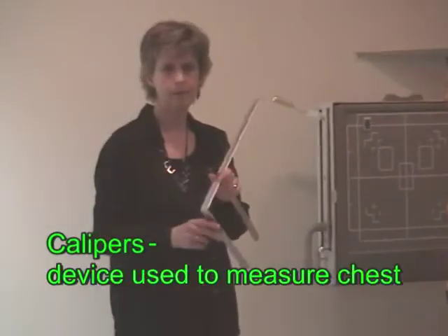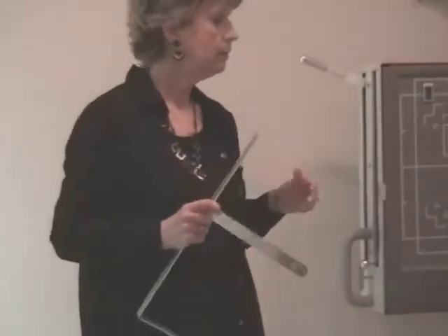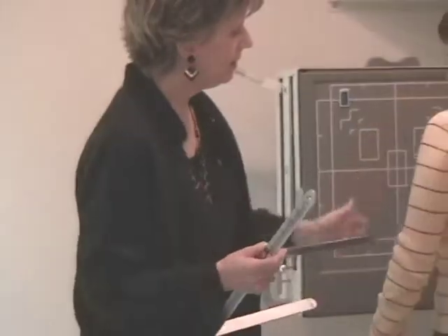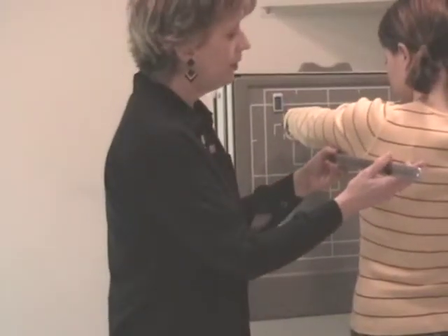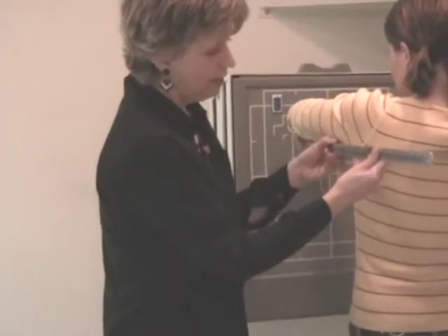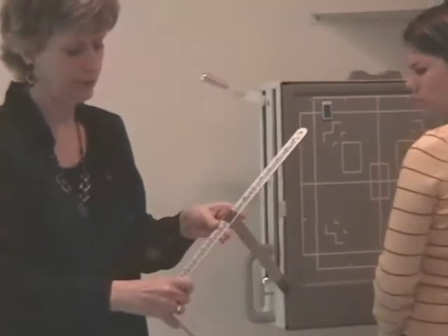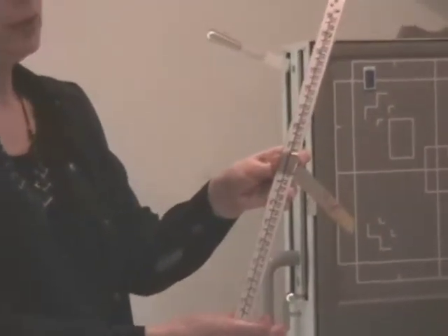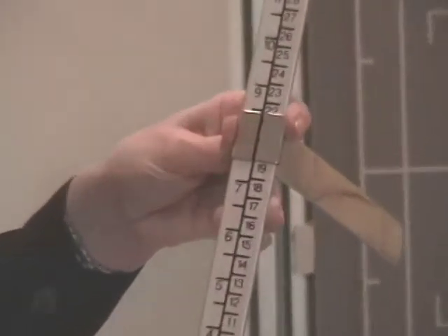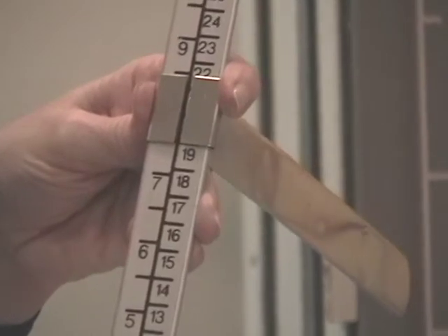So, the device that we use. I will have my patient turn sideways and bring their arms up. Take a deep breath in, please. And I will take a measurement. You may breathe. And if you can see, it measures 19. You might ask what I'm going to do with this information.